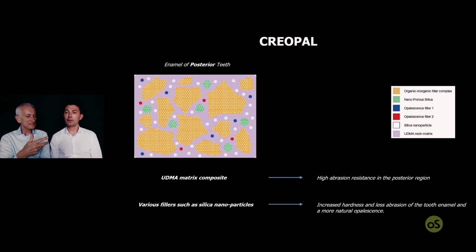So when you say resistance, you mean resistance to abrasion, or resistance to impact loads and forces? For sure, in the abrasion. Okay, so there is the wearability. The wearability resistance, sorry, yes. And it doesn't change if the tooth is full contour or veneer.